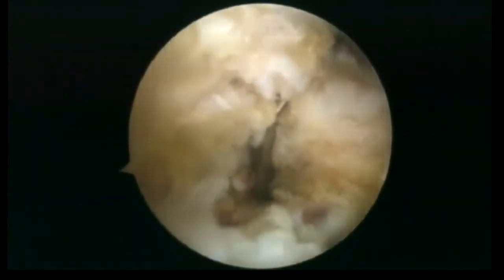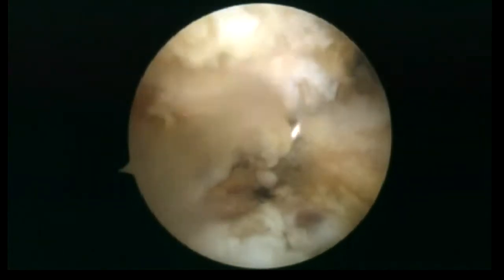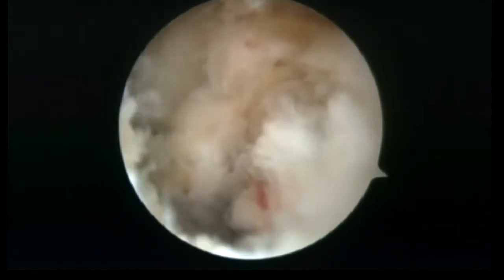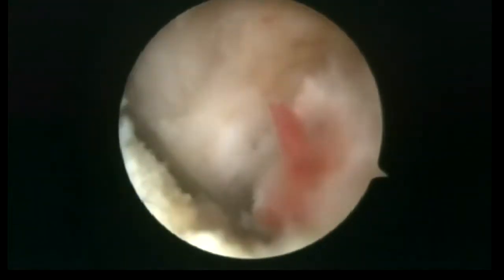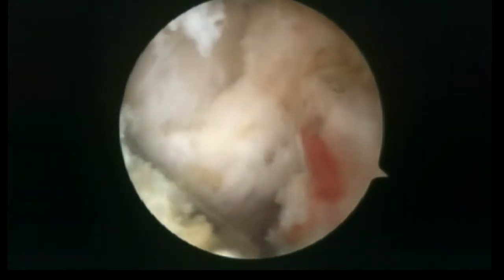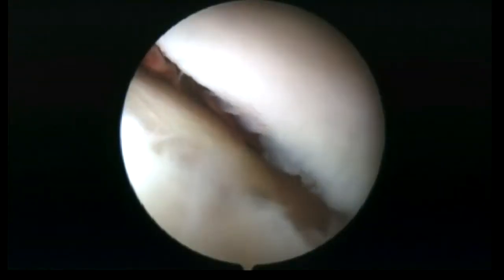The bone chisels, introduced first through the mid-lateral portal and then through the posterolateral portal, are used to mobilize and elevate the posterolateral fragment. The fracture reduction should be observed with the scope in the anterolateral viewing portal.